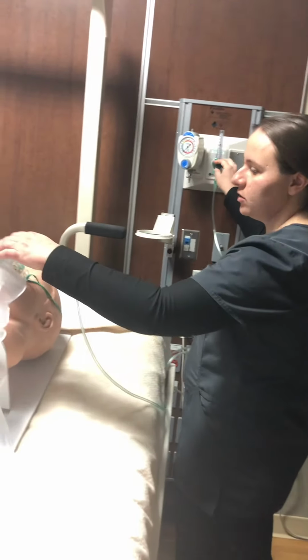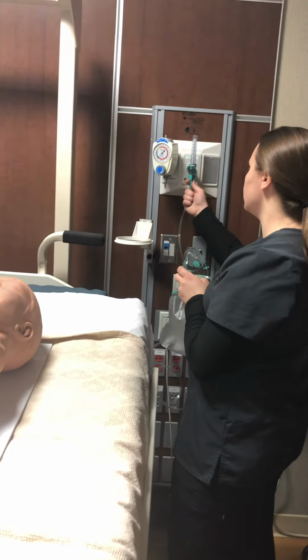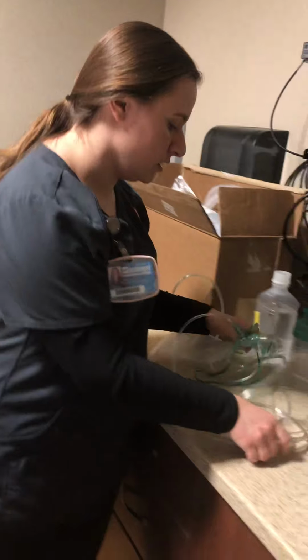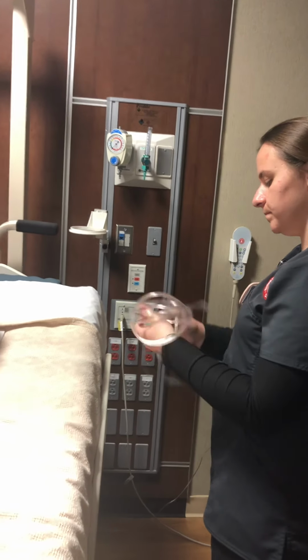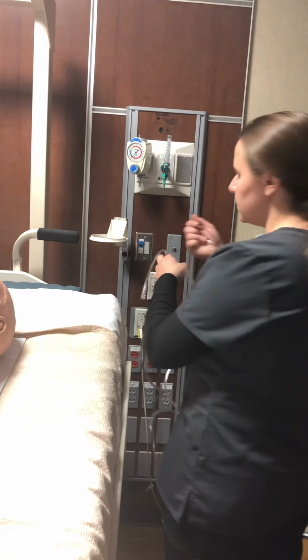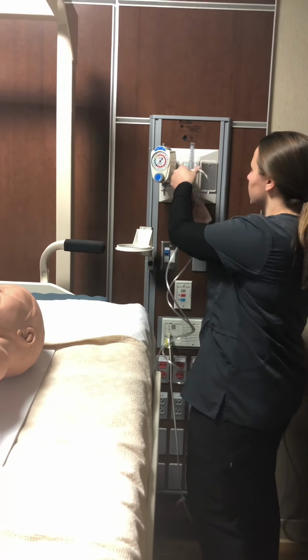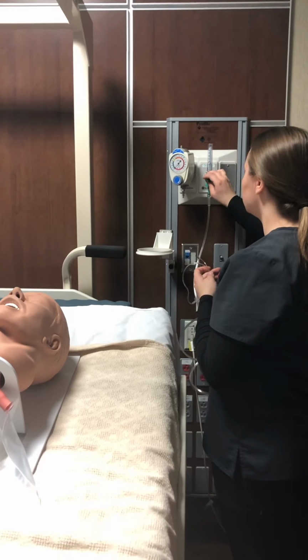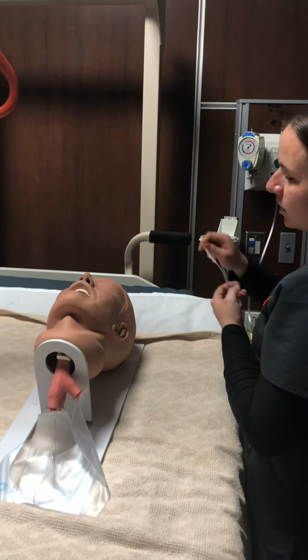So I'm going to change this off. They were at a lower flow with this, and they're going to go to a nasal cannula. So I'm going to set them at the appropriate flow for them. Alright, so here we have a nasal cannula, and this is just going to help you, and we're going to start weaning you off of oxygen, okay? Your levels are going back to normal, and I'm just going to make sure that you are still getting the appropriate oxygen, and I'm going to come back and check on you.